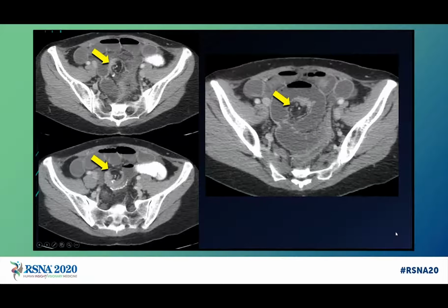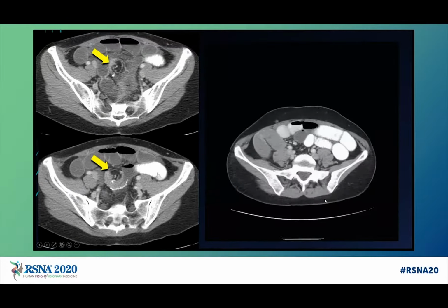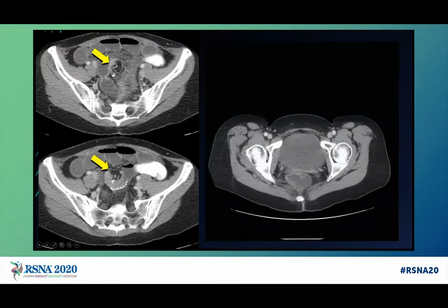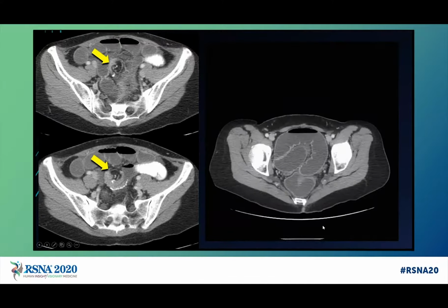This is another patient with an adhesion causing small bowel volvulus. Notice the dilated small bowel twisting around this central point of the mesentery adjacent to this anastomosis. Easier to see as you scroll through this case here where you see this rotation of at least 360 degrees of the small bowel mesentery, complicating this patient's small bowel obstruction.